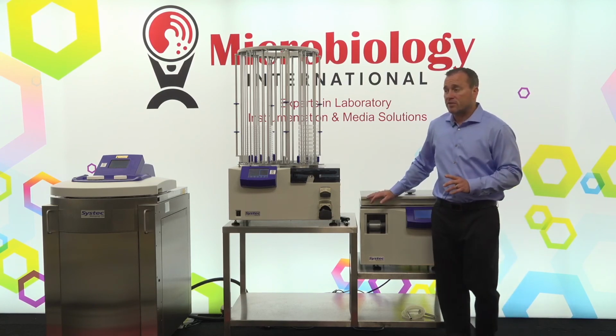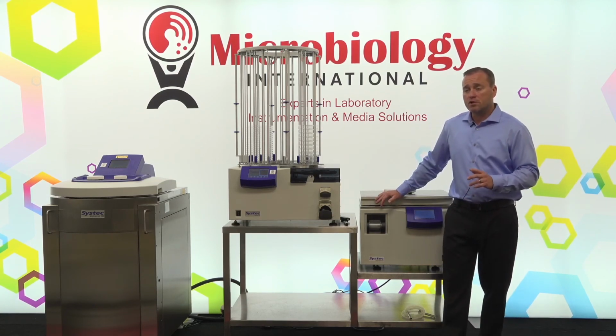That unit is about the size of a computer tower, so it is very small, requires one 115 volt outlet, so very easy for us to install that in conjunction with the MediaPreps.